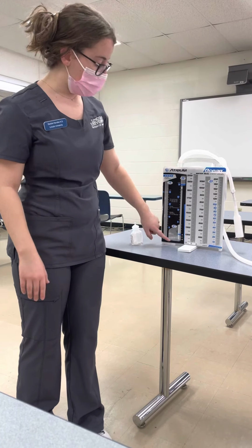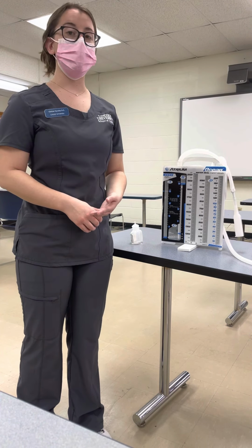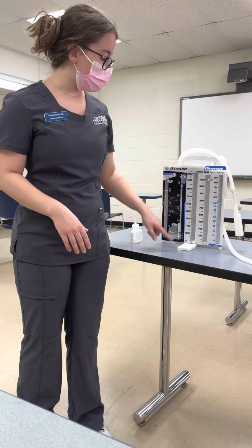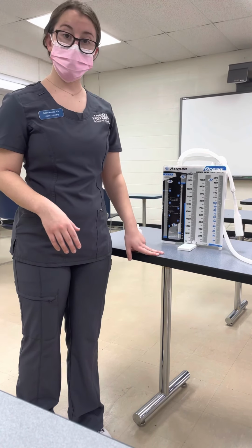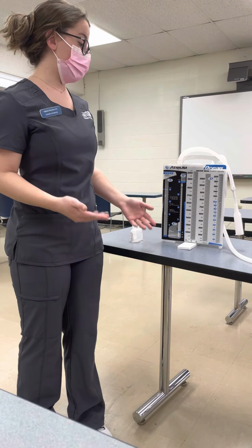It is normal. As far as air leaks, we can see those normally in the very beginning stage of placement of the chest tube, but if they get excessive bubbling here or continuous bubbling, that is a cause for concern because that does indicate an air leak is occurring.